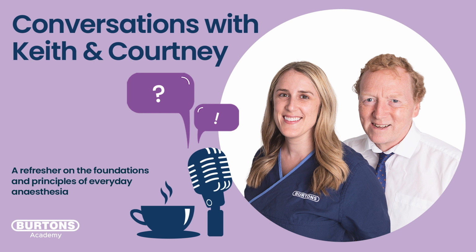So I think that's kind of a little myth we need to dispel, that you need to use neuromuscular blocking agents or you need to have some sort of special anesthesia technique to be able to ventilate. But you don't. You need to have a procedure that enables you to exploit those mechanisms that we've just discussed. Yeah, and an understanding to do so.